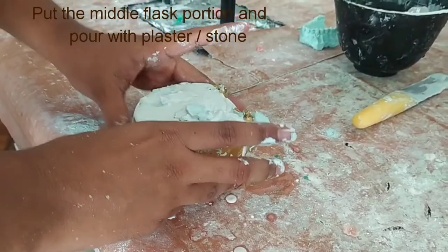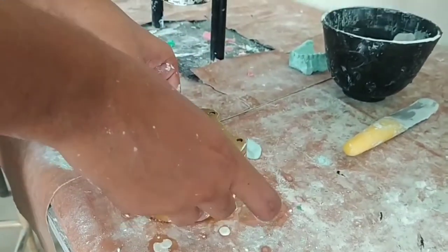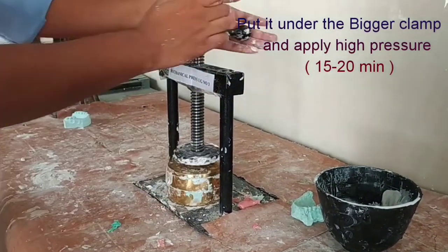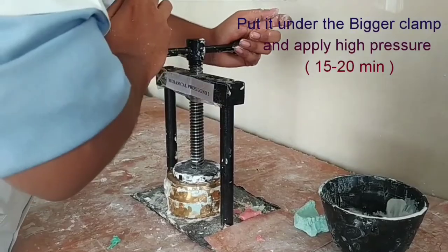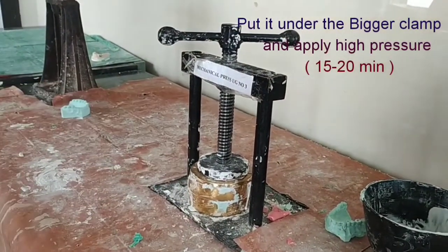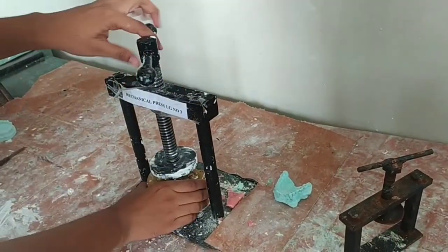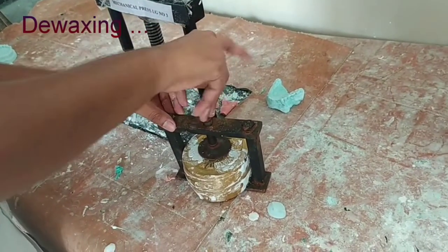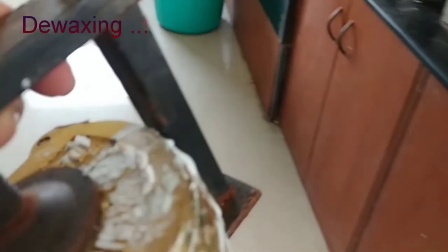Fill it completely and put the lid on it, then put it under the bigger clamp and apply high pressure. Excess material will flow away and we let it sit for 15 to 20 minutes. After it sets completely, remove it from the bigger clamp, put it on the smaller one, and then place it in the de-waxing unit for 5 to 10 minutes.